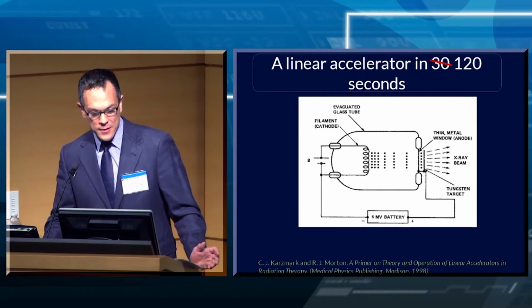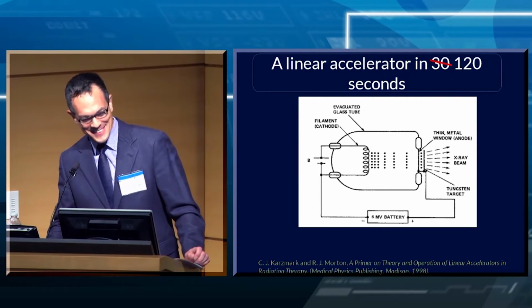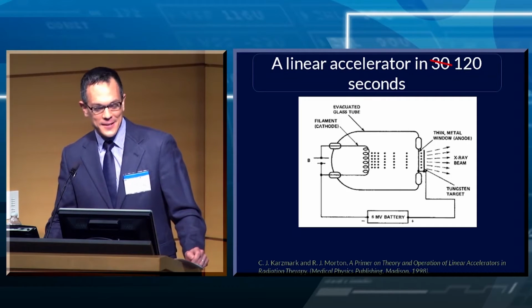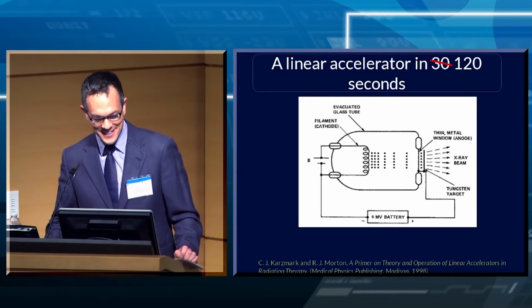So the classic way you use this is with a linear accelerator. So here's a linear accelerator in probably 120 seconds, because it's a little more complicated than a Gamma Knife.